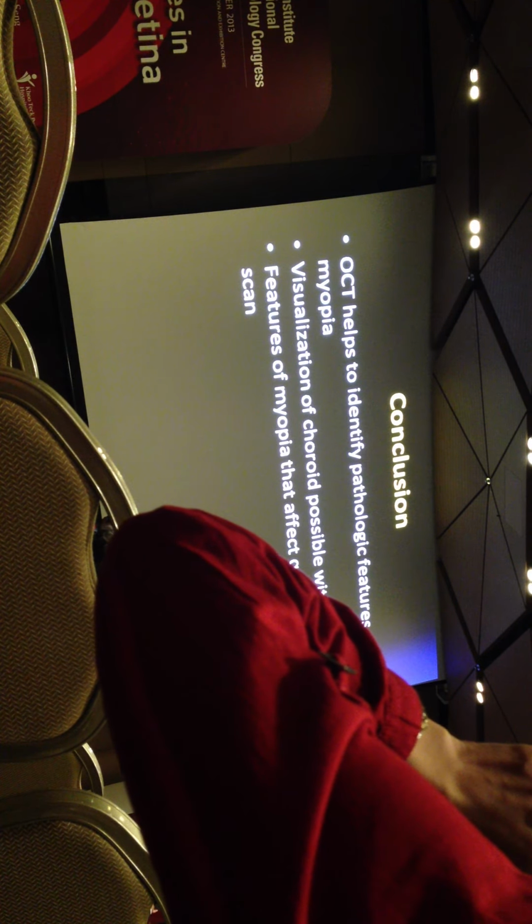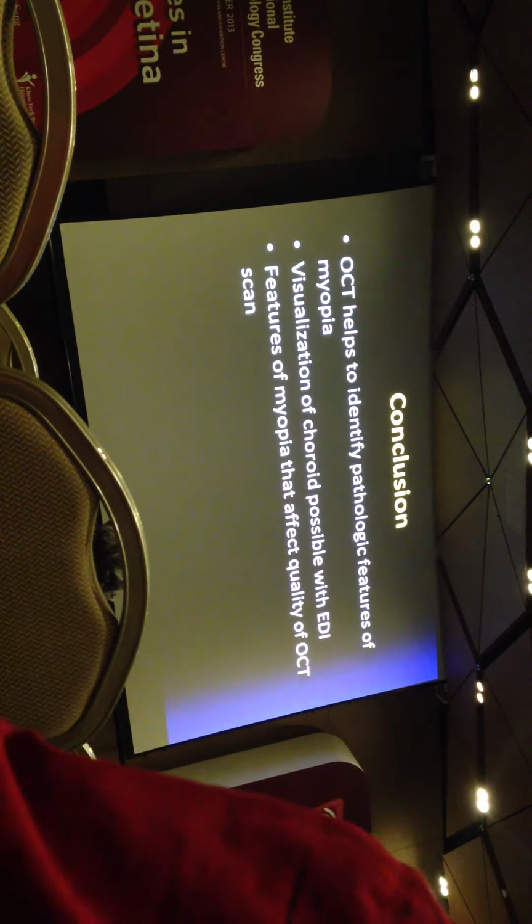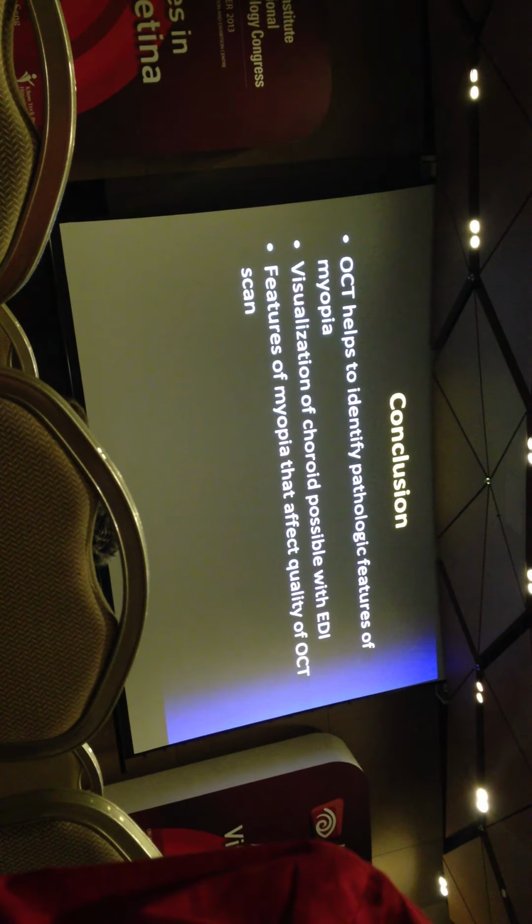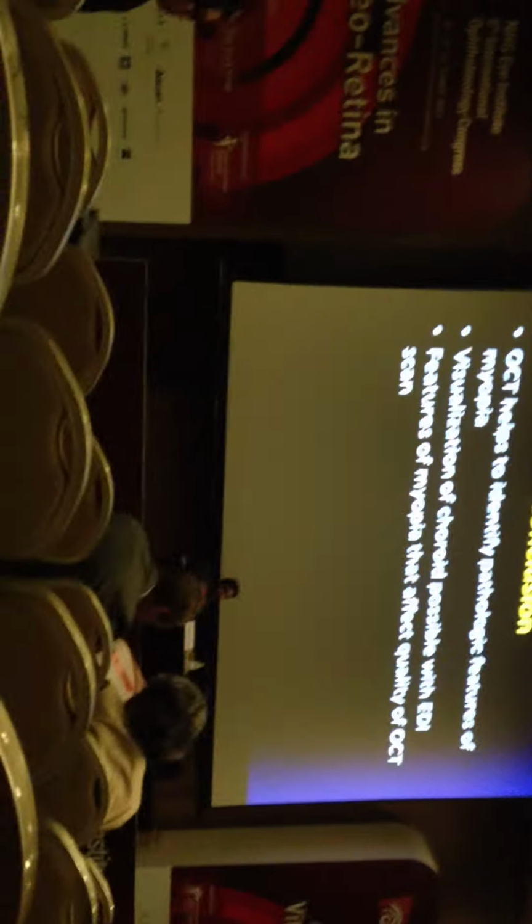Okay, so in conclusion, I think OCT is very helpful in identifying the pathologic features of myopia. We can visualize the choroid with EDI, and this is something that is important because we always suspect that the choroid has a role to play in myopia. And also we must always remember the features of myopia that affect the quality of the OCT scan and our interpretation of it.